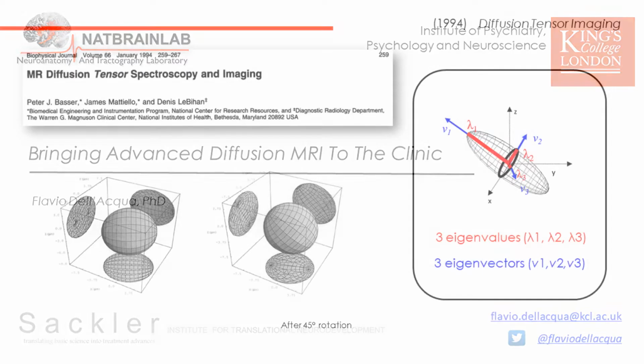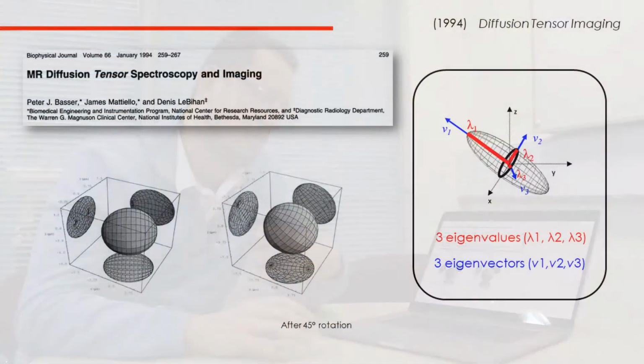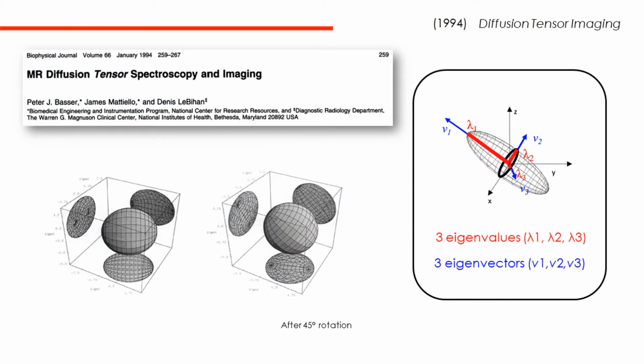So as you know, when we talk about diffusion, we talk about diffusion tensor imaging, and diffusion tensor is a special imaging technique, different from any other method, because we are not just taking a picture of the brain, but we actually measure how water moves inside the brain. So we have almost a vectorial three-dimensional information on how water molecules move inside the brain, and because of this we can actually see how fibers and microstructure are organized. So for the first time we can actually have directionality. We can see where fibers are going in different parts of the brain.